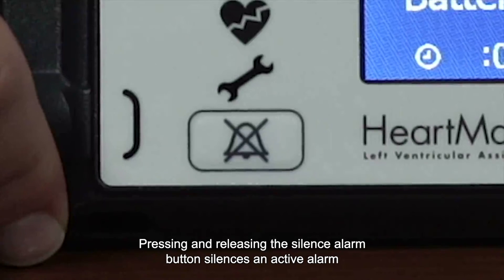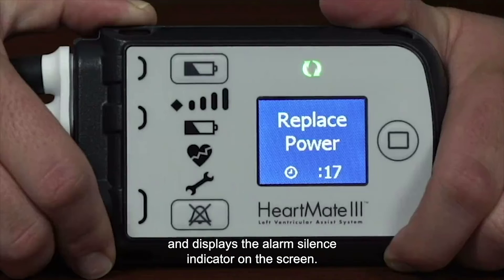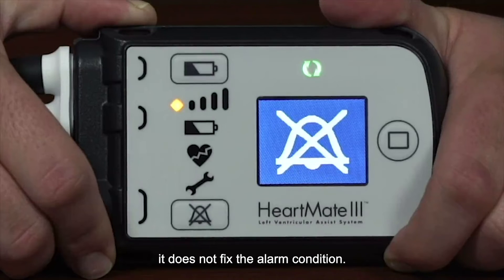Pressing and releasing the Silence Alarm button silences an active alarm and displays the alarm silence indicator on the screen. Please note that it only silences the alarm — it does not fix the alarm condition.